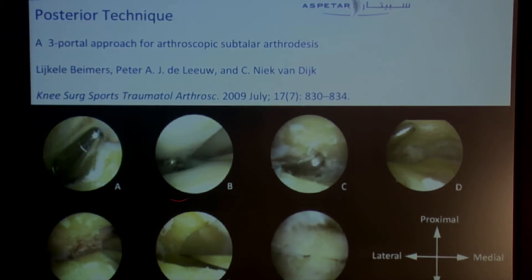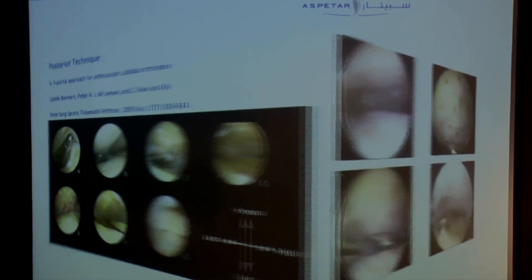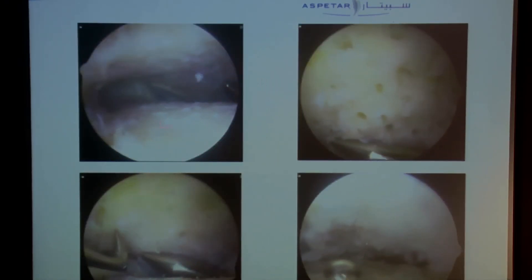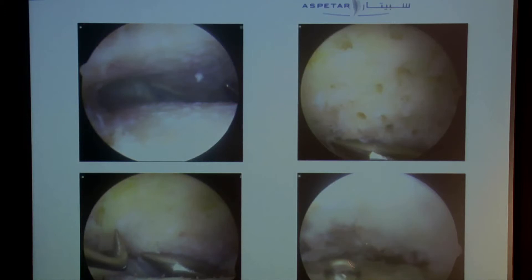I really clean out, delaminate, remove the coalition, and make the fusion happen. During arthroscopy, you can see the real delamination of the articular cartilage on that region. We do the microfracture technique in order to have bleeding bone within the two-fuse region.